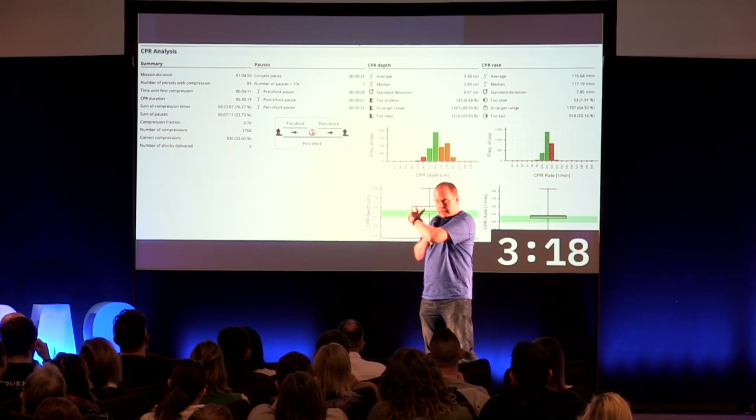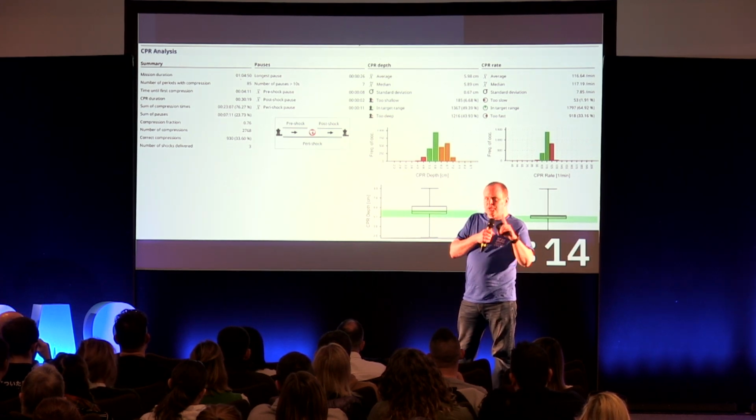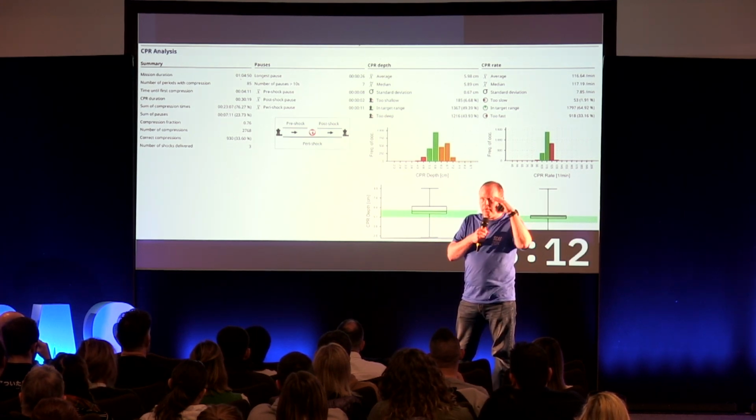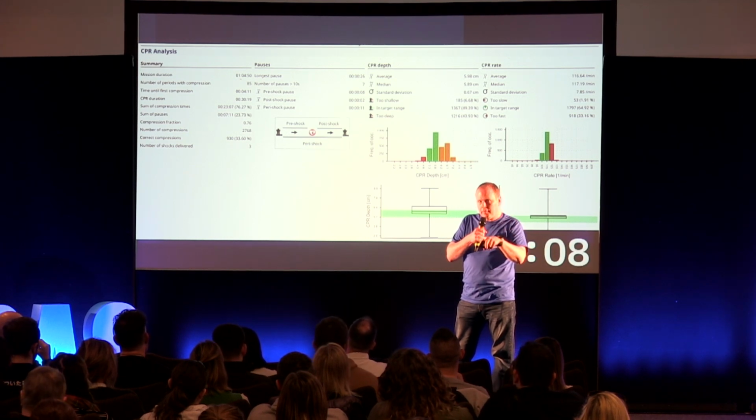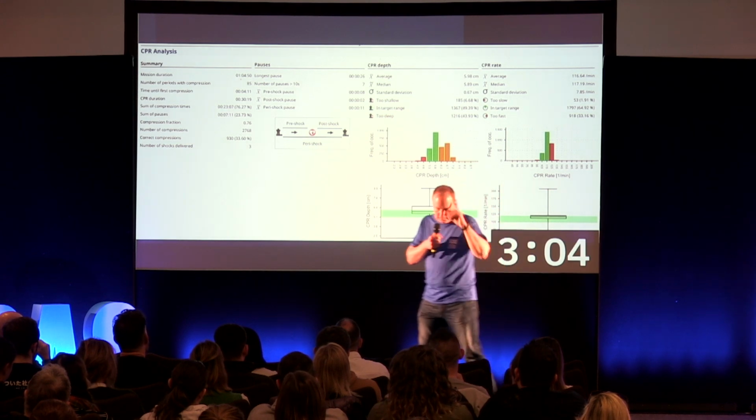By the way, the little histograms, you can print off from your defib after an event. I'm not quite sure how to do it while it's still a live job, but if you go into the archive, select the last cardiac arrest, there's a CPR button, and it'll print this out. It's a great little tool for a hot debrief, just a top tip.